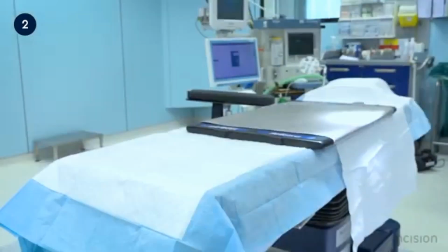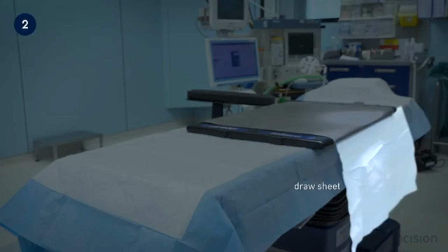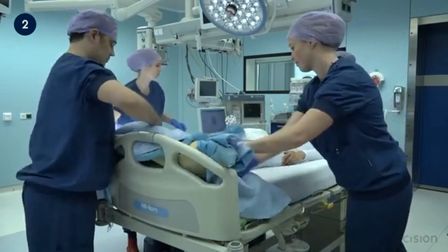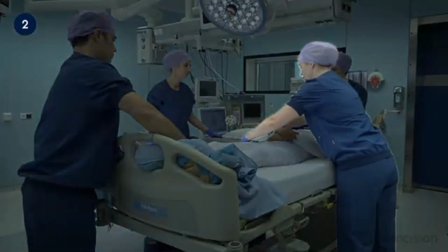They have responsibility for ensuring that spinal alignment is maintained during the transfer, and are also responsible for the patient's airway. Take note of the transfer rollerboard, which is used to slide the patient from the bed onto the surgical table, as well as the draw sheet, which can be used to adjust the patient's position once safely on the table. At the direction of the transfer leader, the patient is first rolled onto their side, with this team member positioning her hands at the patient's hip and shoulder.